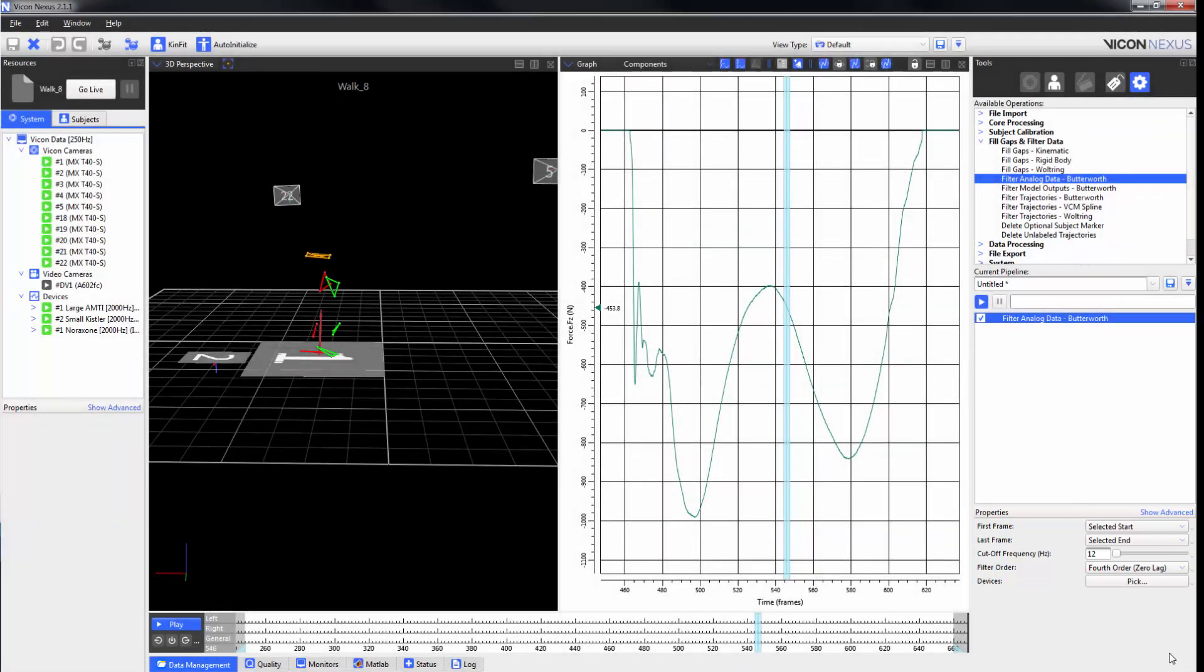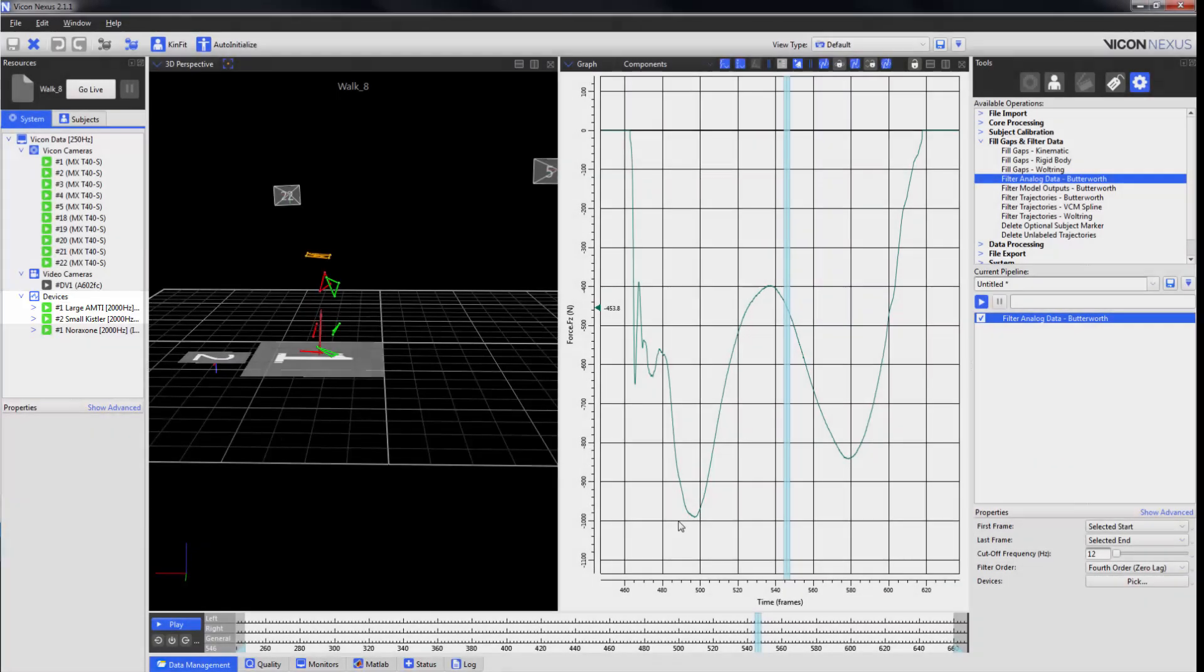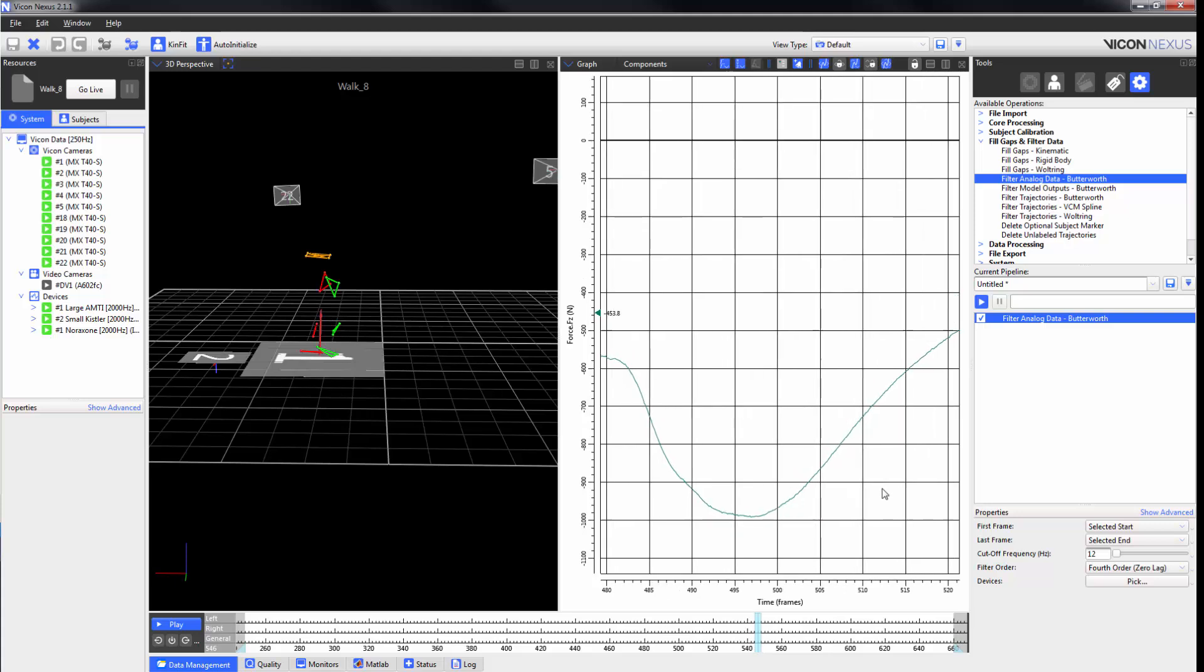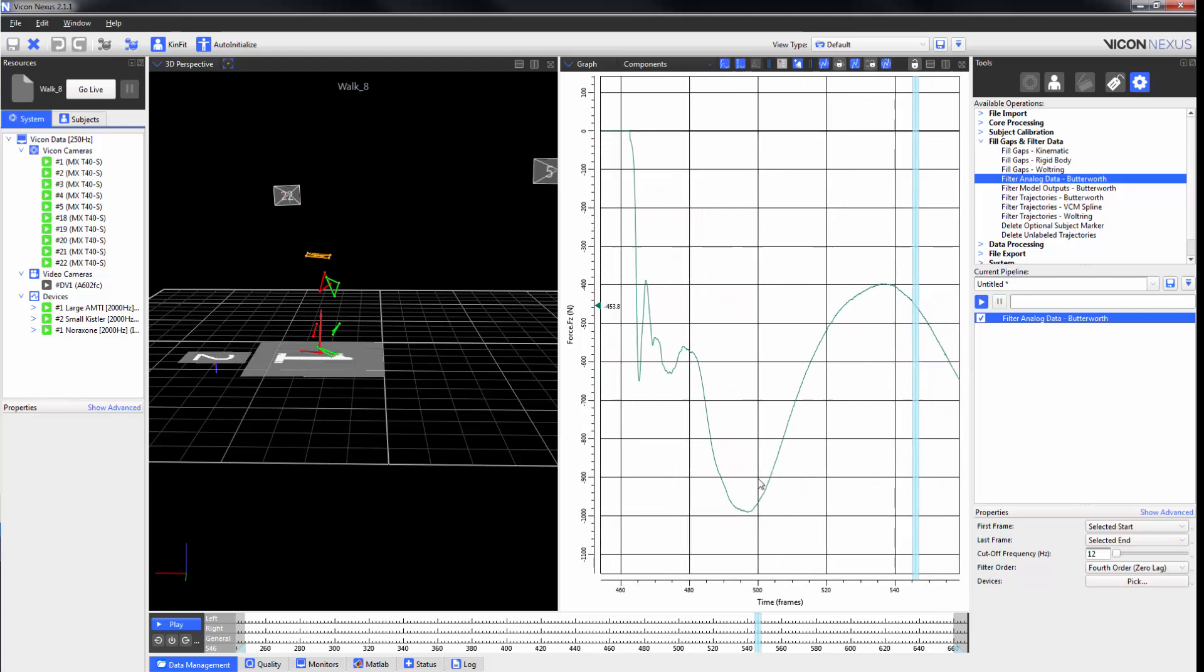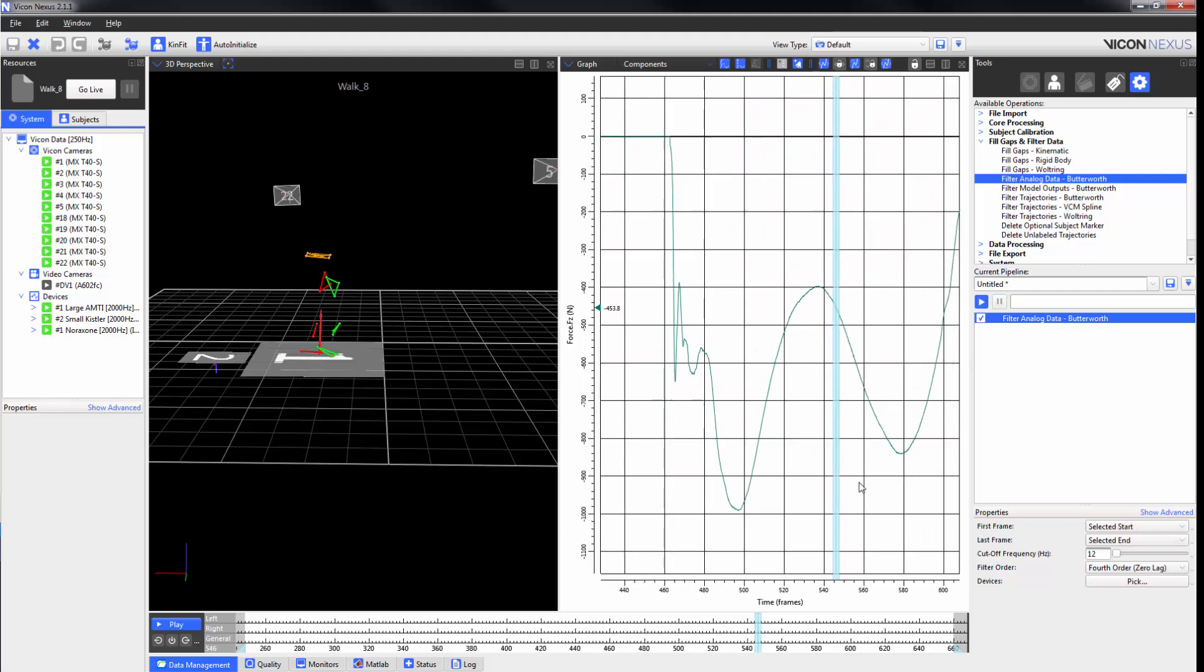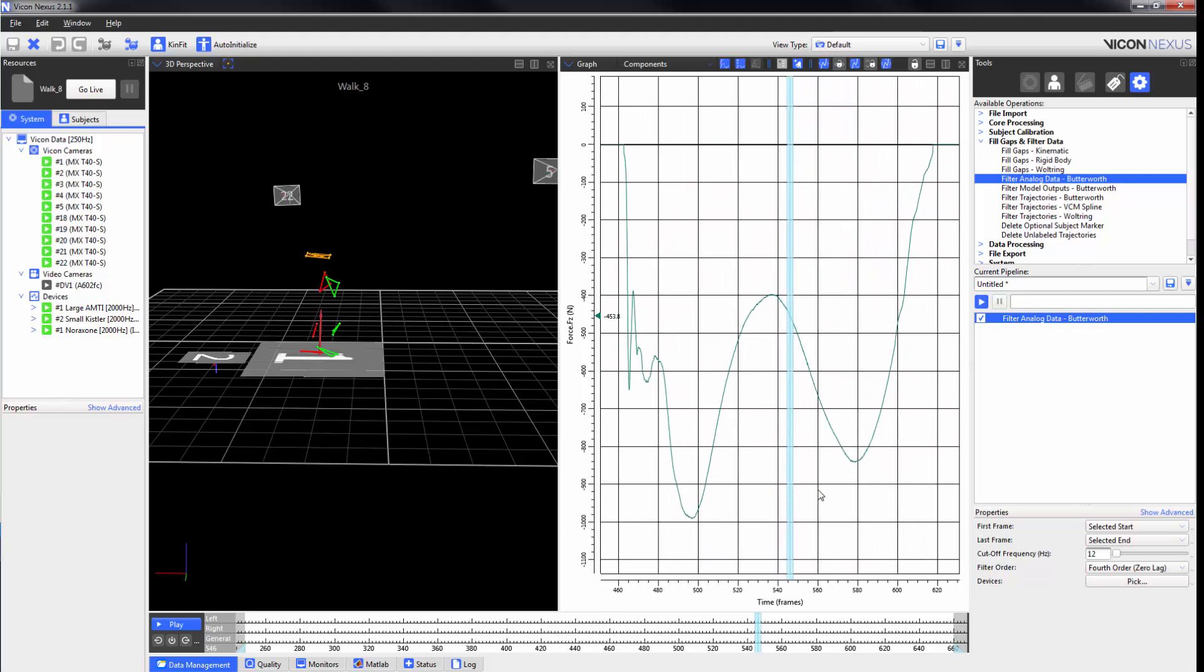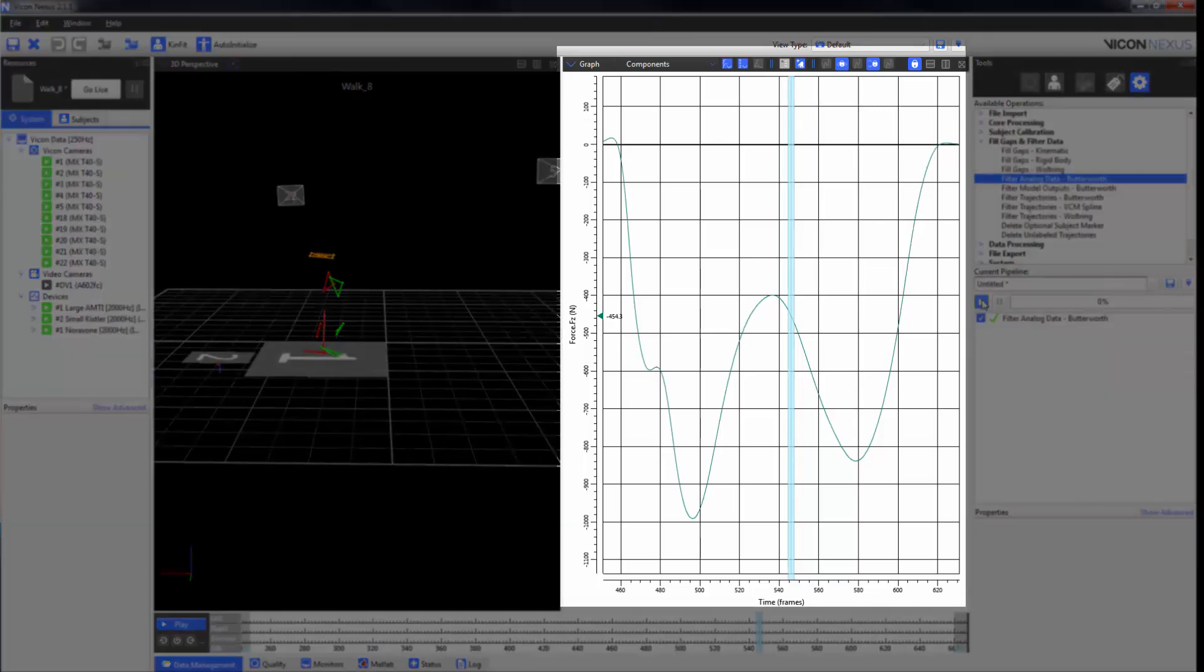In this example here, I have got my FZ of my first force plate selected. And we can see here, if I zoom in, that there is a little bit of noise over here. Now if I lock my screen and run the filter, we can see that the filter has been applied.